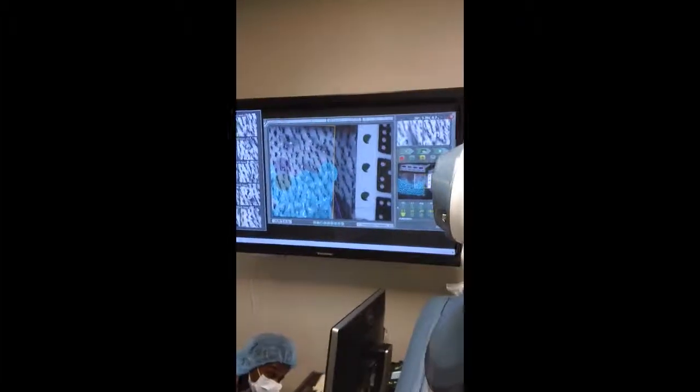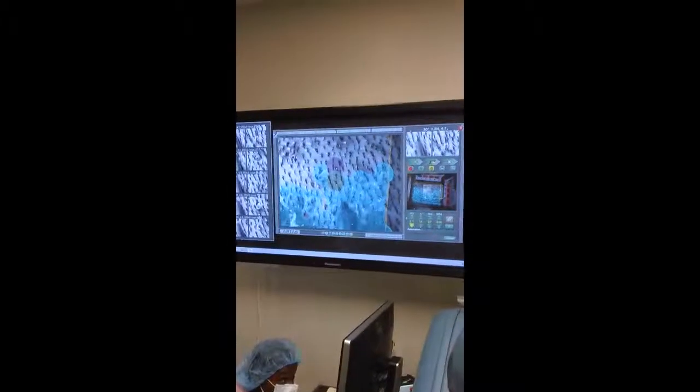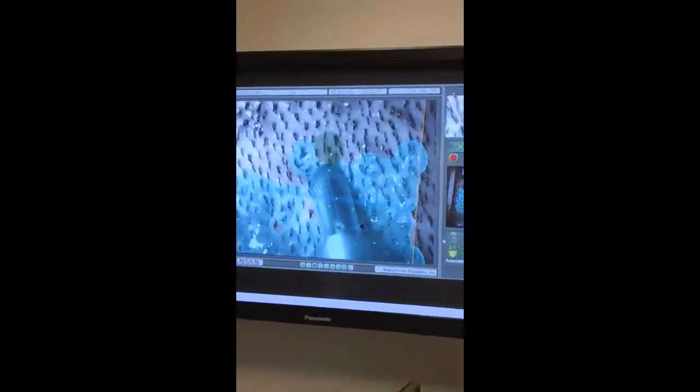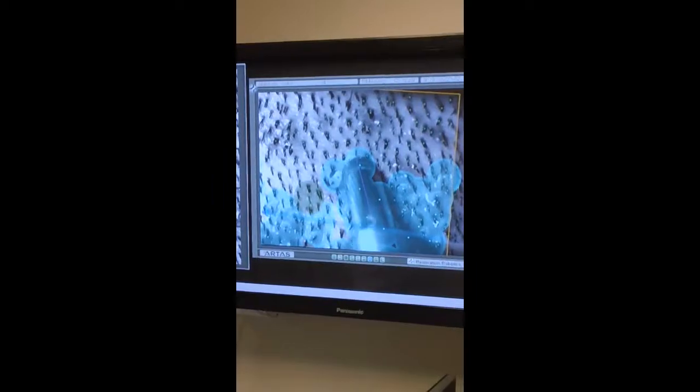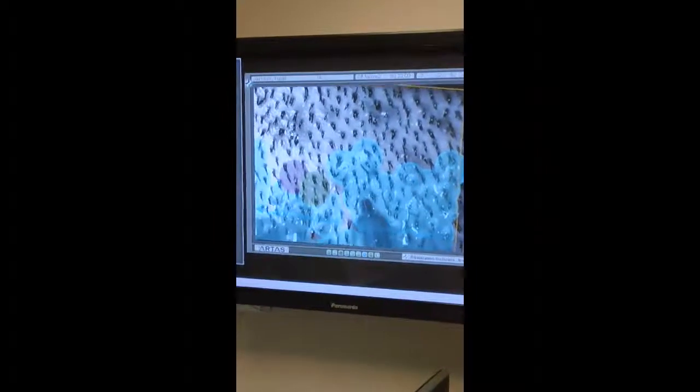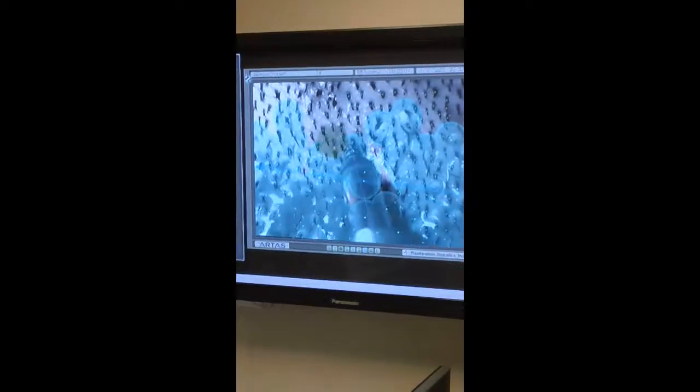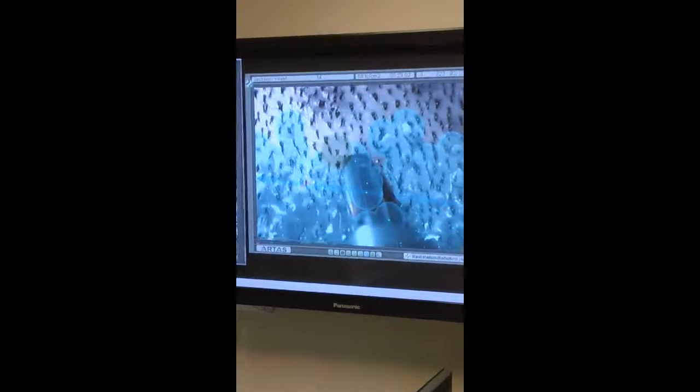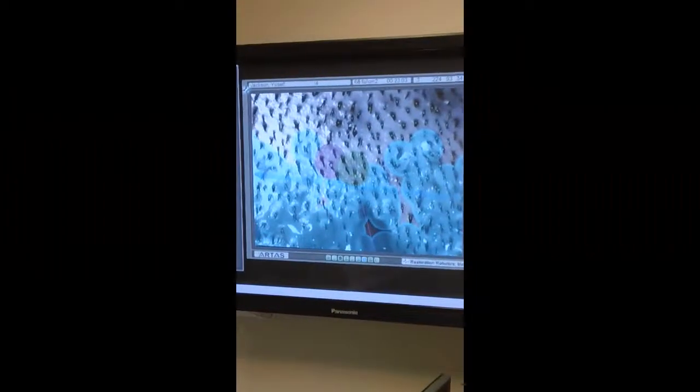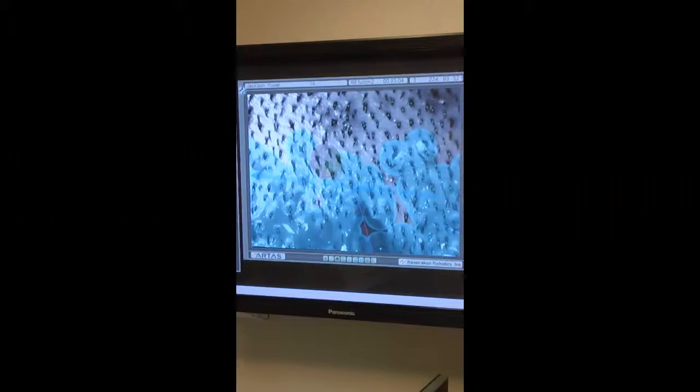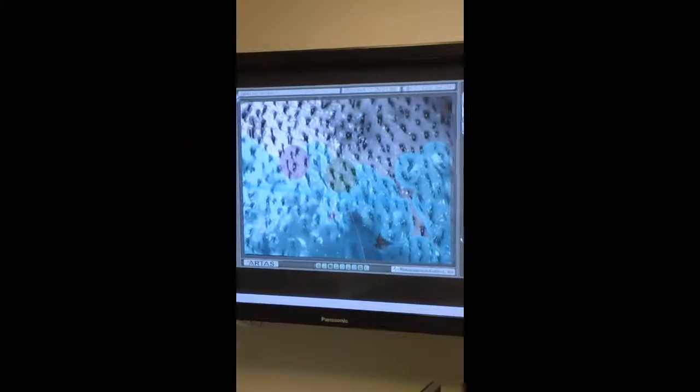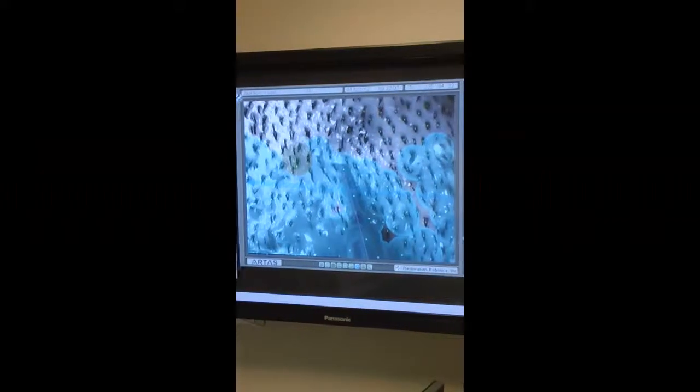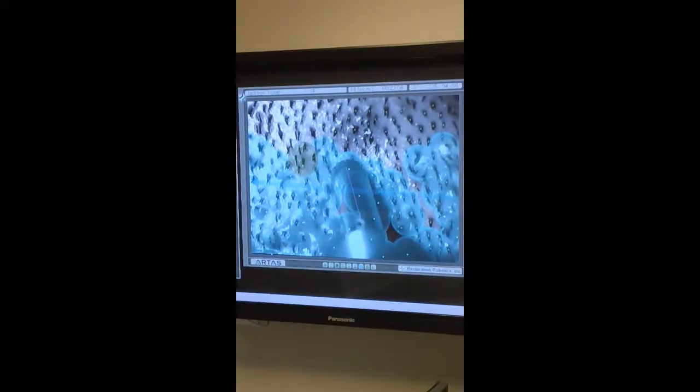We've already examined several. If you look at the picture, you see the instrument spinning perfectly, the graphs are elevating perfectly, and of course you have to change the settings a little bit to do what you need to do.